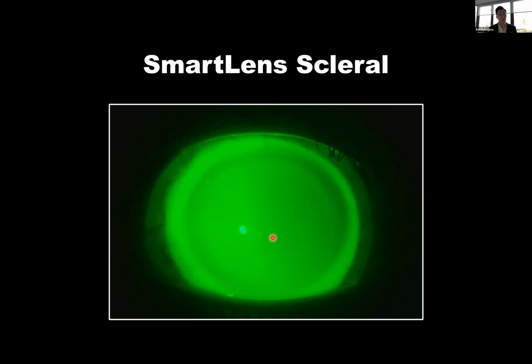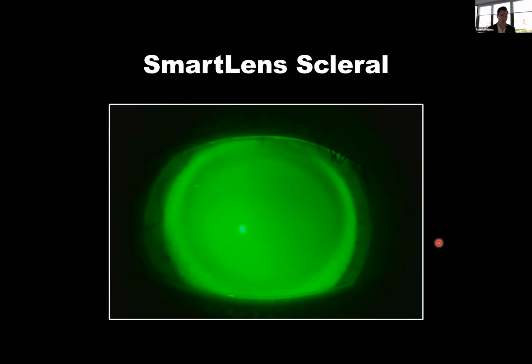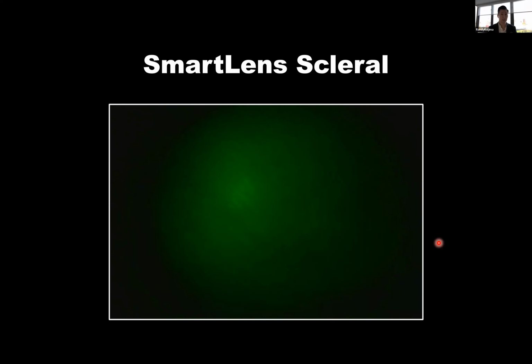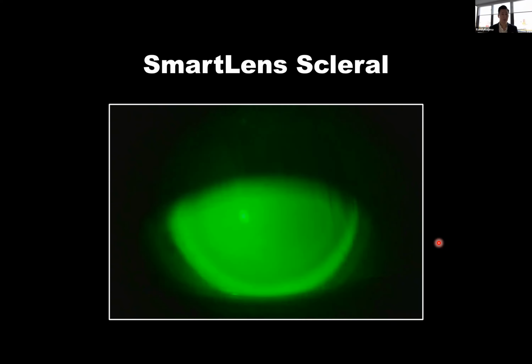Now, if we need to go scleral, and of course, it's hard not to choose a scleral lens for the irregular eye because it's so comfortable. Why is the scleral lens so comfortable? It's 3 times the thickness of a corneal GP. It's 6 times the thickness of a soft lens. It's something like 40% bigger than a soft lens would be, and like 1.5 times the size of a corneal GP in surface area. The scleral is huge.